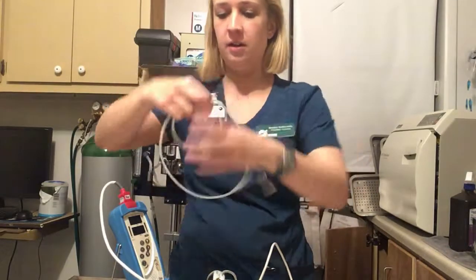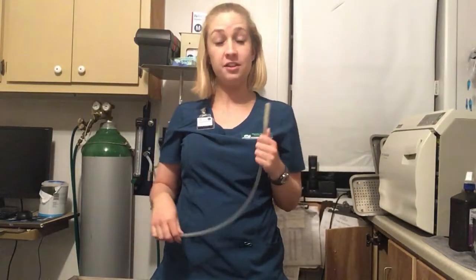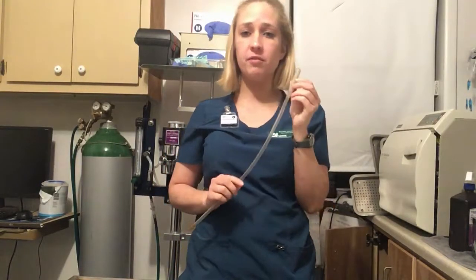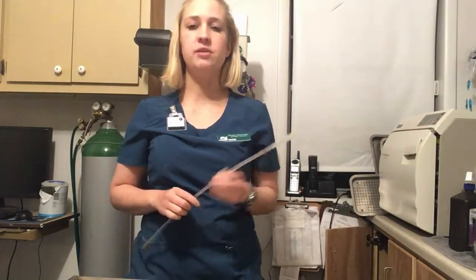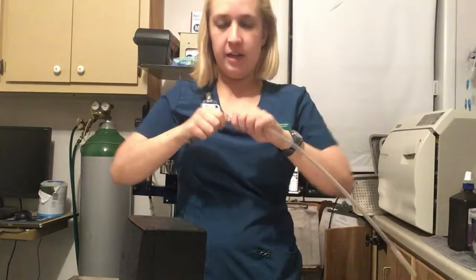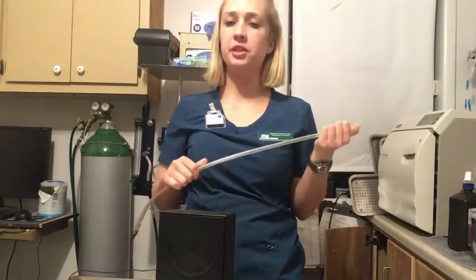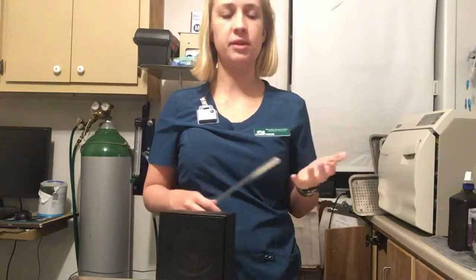So the next piece of equipment that I'm going to go over is the esophageal stethoscope. What this does is it's literally a little bit of a microphone at the end that will pick up the heart rate and the respiratory sounds. You attach the end of it to an amplifier, and we have it attached to a speaker system that will be going during the procedure. That way we can literally listen to the heart rate and the respirations.